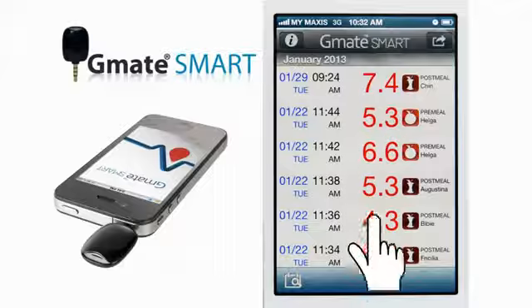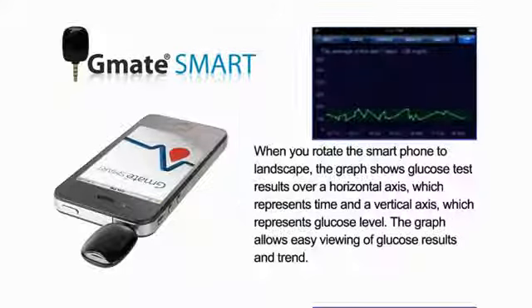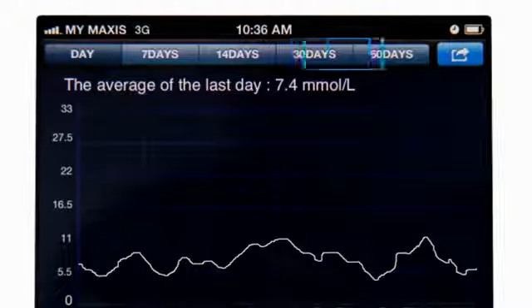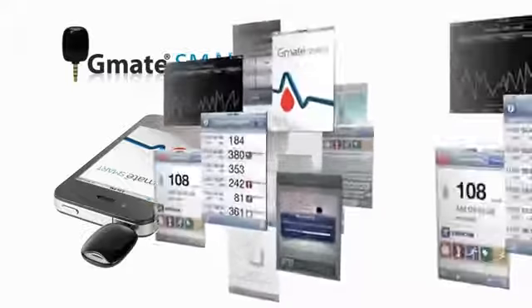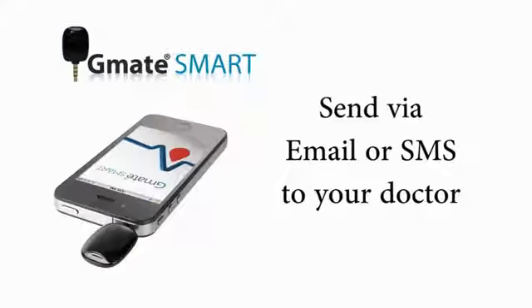Touch one of those results and the detailed information will appear. When you rotate the smartphone horizontally, the results convert into a graph which represents your glucose level. Touching the button at the top of the graph will change the zoom level and show the average of the last specific period. The application keeps track of all the results and is even capable of emailing or SMS-ing the results to your doctor.